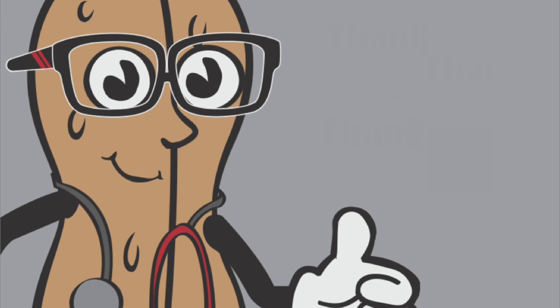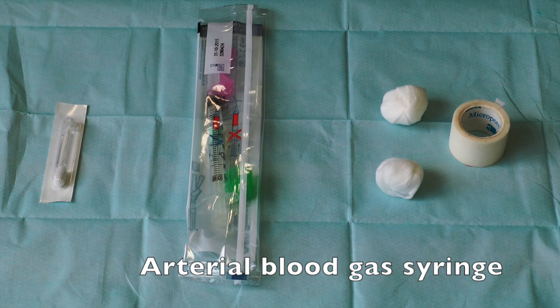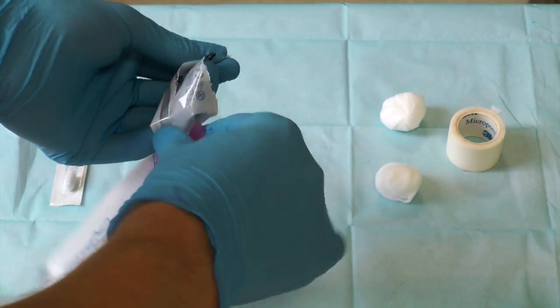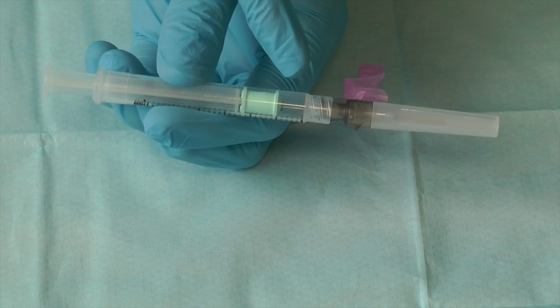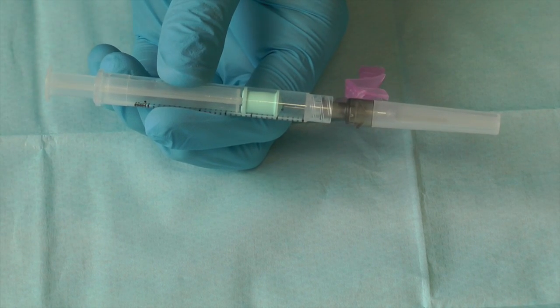The key to success is preparation. You will need a cleaning stick, an arterial blood gas syringe, and cotton swabs and tape. Remove the syringe from its packaging and note the safety cap. This syringe is heparin coated. Some syringes come with heparin which needs to be expelled.